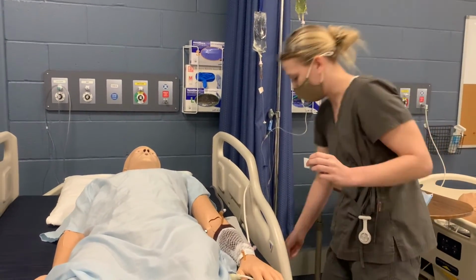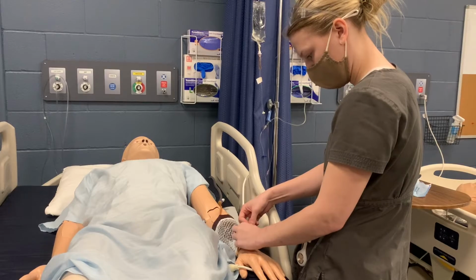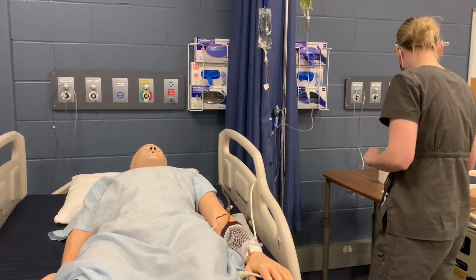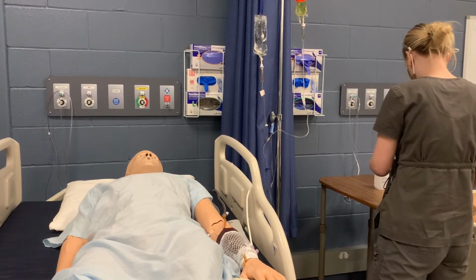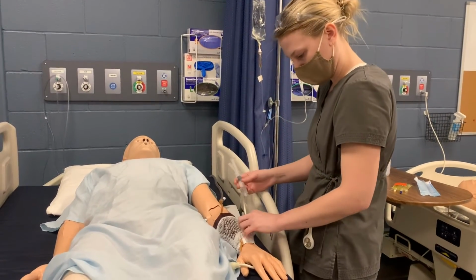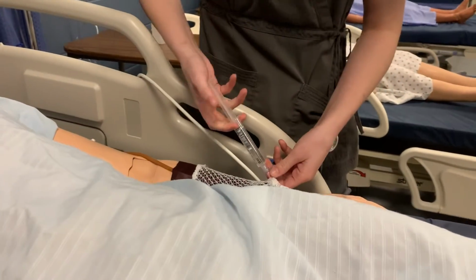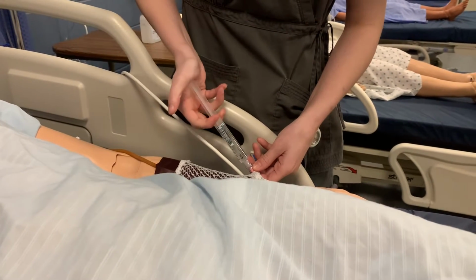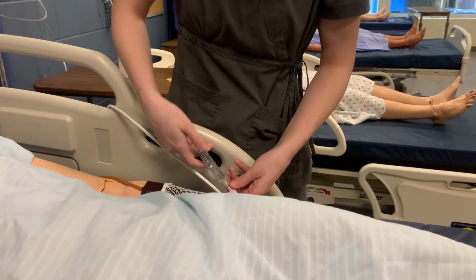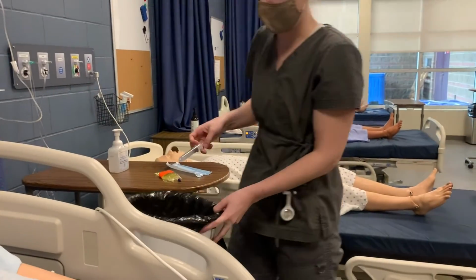So I'm going to go ahead and get started. I'm going to wipe their saline lock. Just like that. And then I'm going to allow that to dry for a sec. And then this is my saline flush. So now that this is all dried, I'm going to go ahead and connect that. I'm going to do it in just little spurts. And it's not going to work on the doll, so just showing you the motion I would be doing here. So I'm going to undo that. And then I'm actually just going to do this into the garbage for you. So I go.